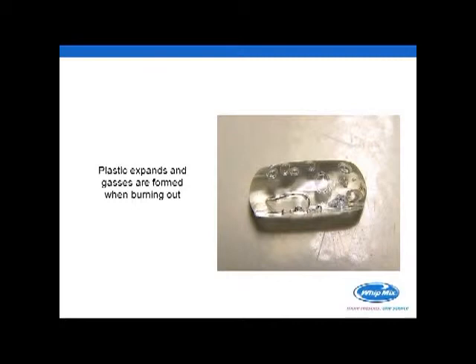That's what it looks like when those little UCLA abutments are burned out. You got a little tiny pole of investment hanging there, and you got a mass of metal starting to fly in there and smack that pole. In that case, what we want to do is reduce the velocity of the casting and also make sure that we enter in a direction that's not going to run directly into that little piece of investment. But in the case of our other plastic patterns, if we simply increase the space between patterns, we've helped to prevent some of the problems that you see.